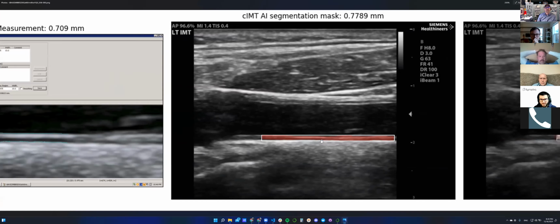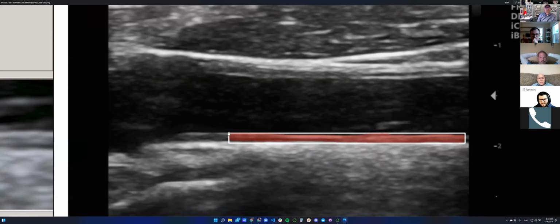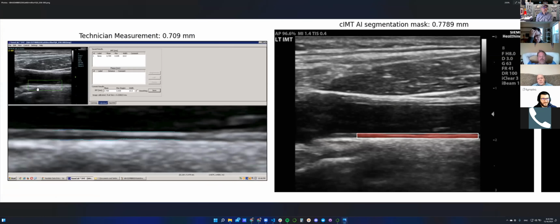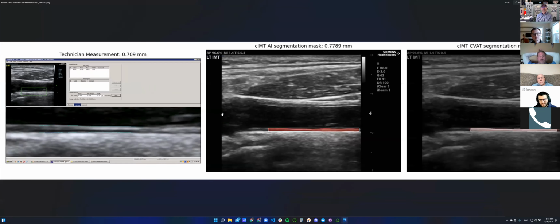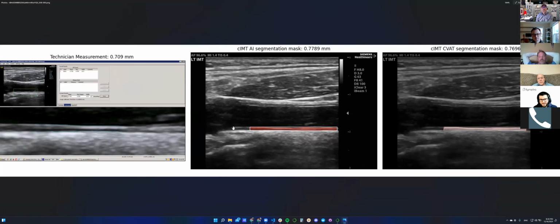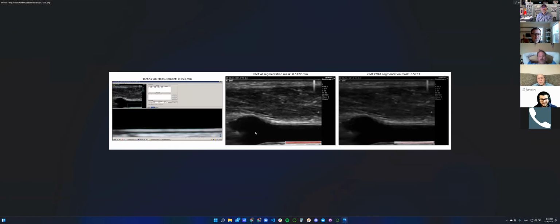Although the problem here, I think, is that we have detected a much larger area, right? At this point, we don't limit our measurements to 10 millimeters. We can do that. It's not super hard because we know the pixel size, so we can calculate a 10 millimeter distance and crop the mask somewhere around here. And if we do that, it will be identical with the region that the technician selected. So there are some cases like that where we overestimate because the network sees all these IMT areas, so this area is going to be segmented.